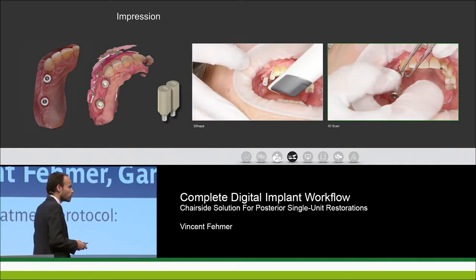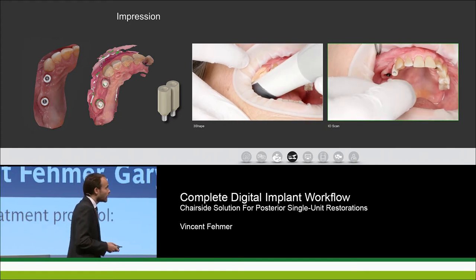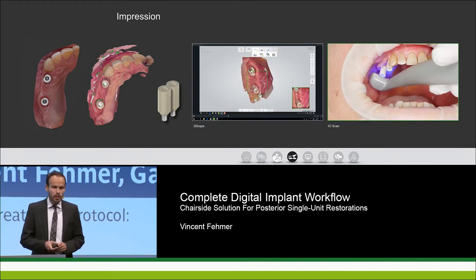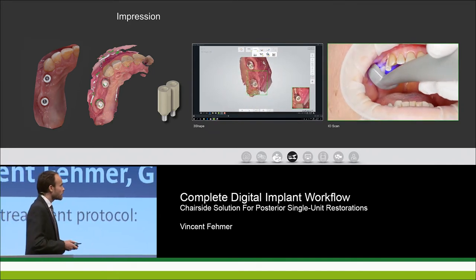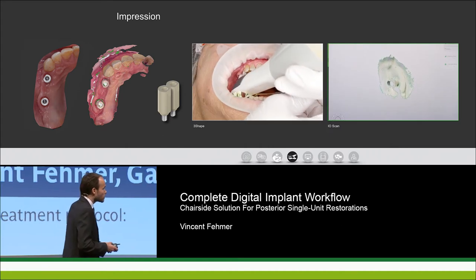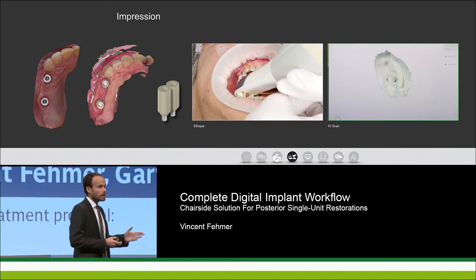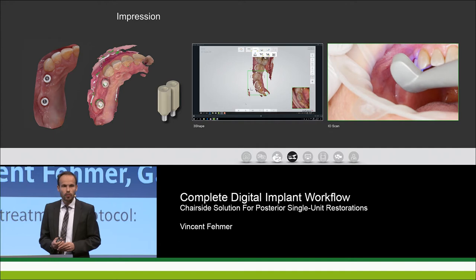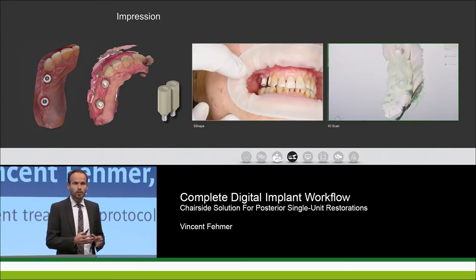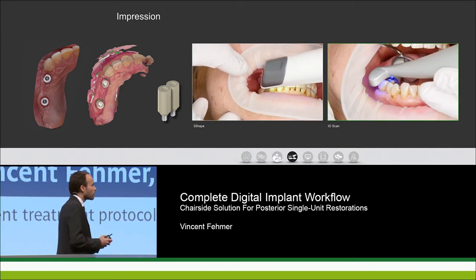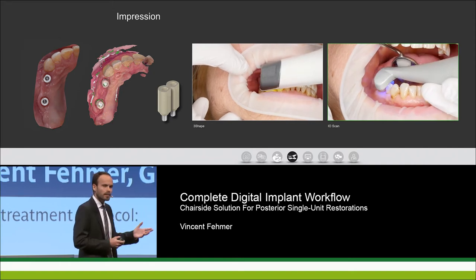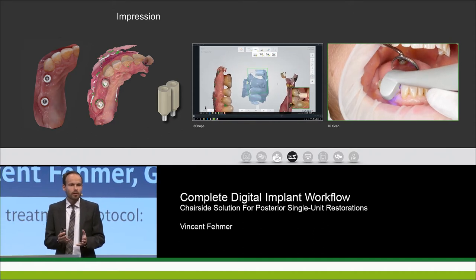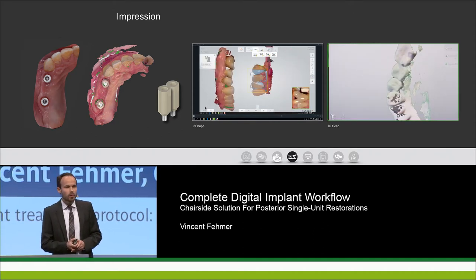On the right-hand side of the screen you see two scans we performed: on the far right the IO scan, and in the center the 3Shape scan after placing the scan bodies and capturing the emergence profile. You see immediately the different appearance: the center scan includes color rendering, while the right-hand side shows more of a green-and-white picture. To be honest, you don't necessarily need the colors, but patients love it.